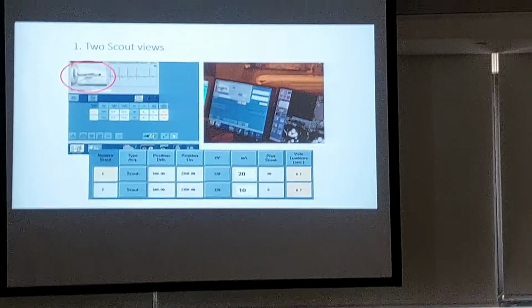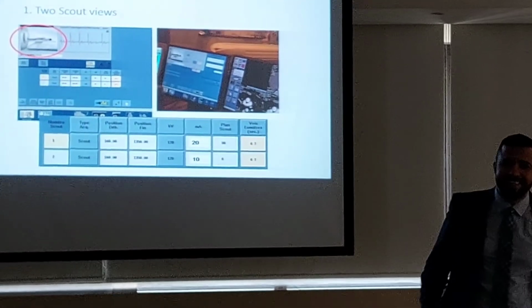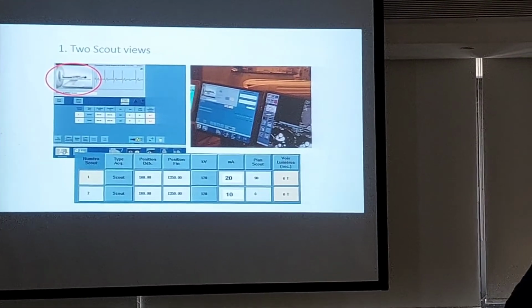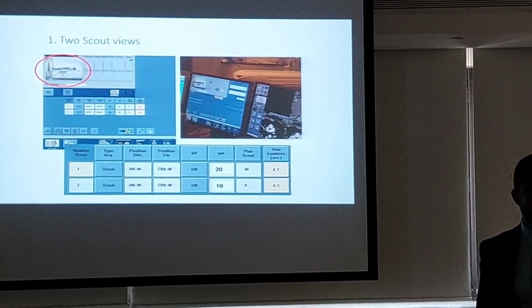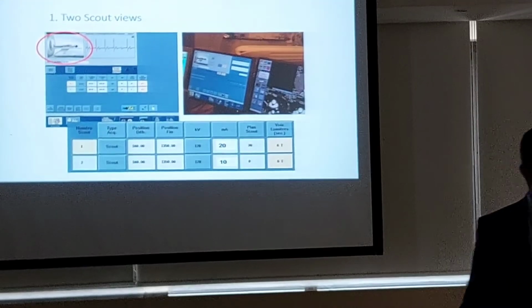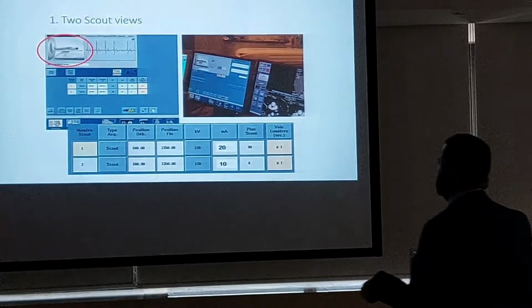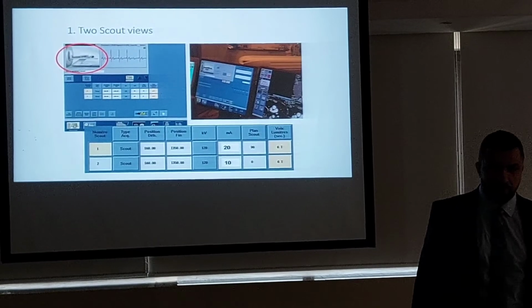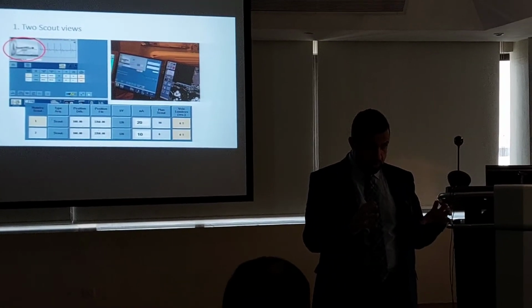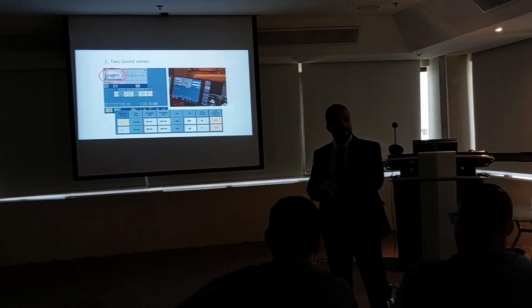Now, in the breath hold instructions, I do recommend the old school way. I tried to convince him. All of the guys that are doing this don't believe in that instruction. But there is a way to do it, actually. Now, it has a logical explanation, because he needs to really control how many seconds it takes to get the minimum heart rate.